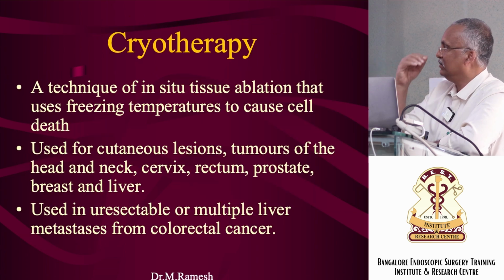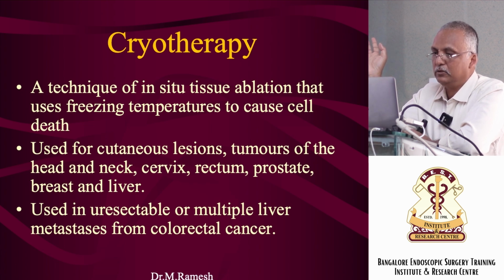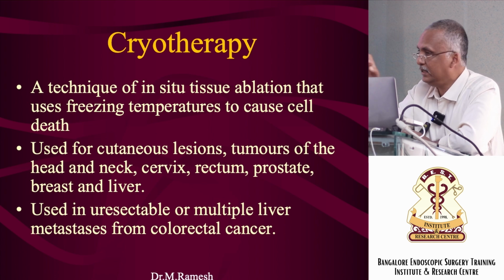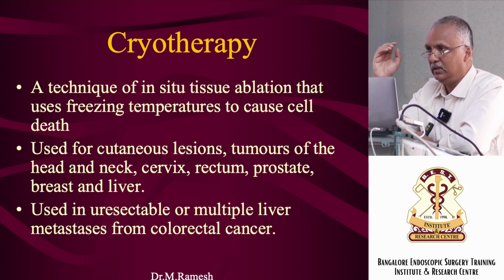Now cryotherapy. Cryo we've been using, but we don't use it like in general surgery, so I don't want to spend too much time talking about cryosurgery. We use it to perform piles operations. We use it for chronic cervicitis. Basically, this is a surgery where you are cooling the tissues, you are freezing tissues. The cells freeze, and because it freezes to such low temperatures, the cells die. Slowly they necrose, they slough out, and they fall off in the next 2 to 3 weeks.